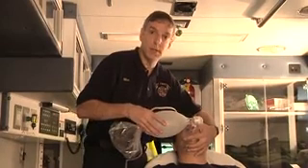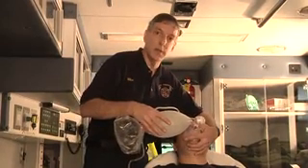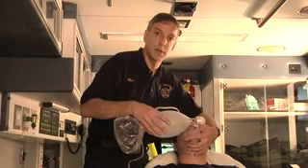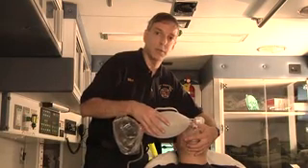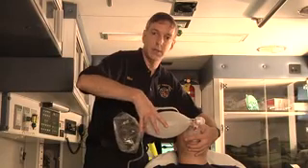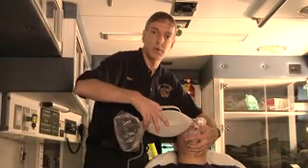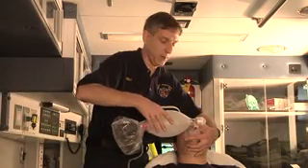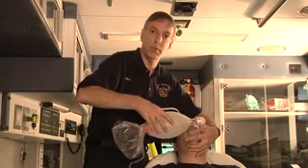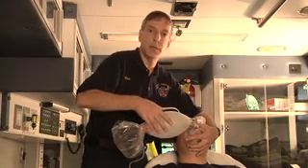And for someone who's spontaneously breathing, there's a challenge in doing this in that you need to coordinate your ventilations with the patient's respirations. So in this patient, we can actually see some denting of the bag as the patient breathes in and out. And our next goal is to try to track the respirations of the patient so that we're breathing for him. Now, monitoring this can be somewhat tricky.